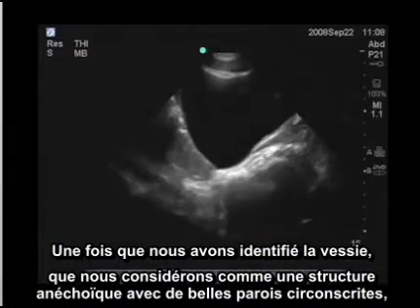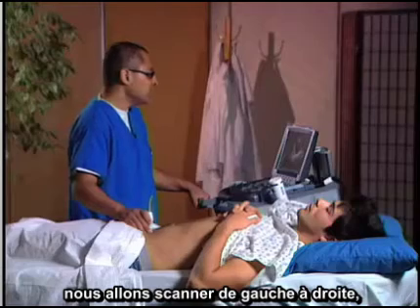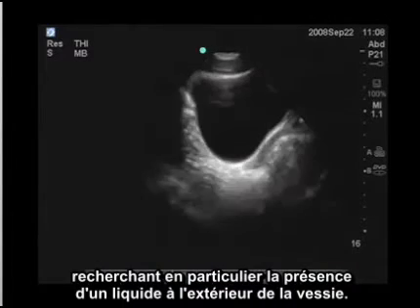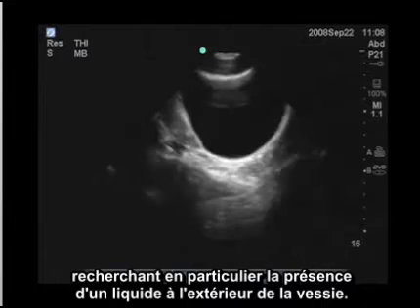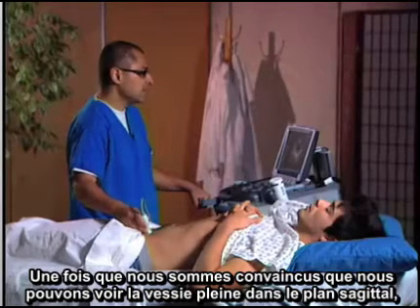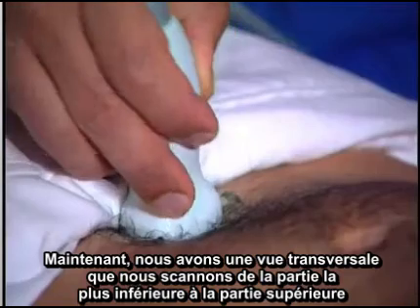Once you identify the bladder — which we see is an anechoic structure with nice circumscribed walls — you want to scan from left to right looking particularly for evidence of fluid outside of that circumscribed bladder. We're looking for free fluid within the pelvis. Once we're satisfied that we can see the full bladder in a sagittal fashion, we're then going to turn the transducer marker toward the patient's right and scan again.